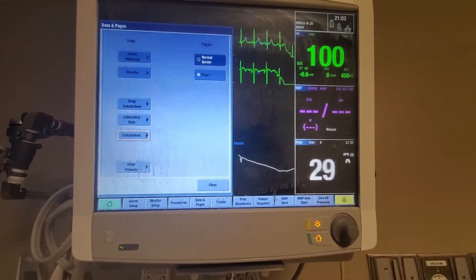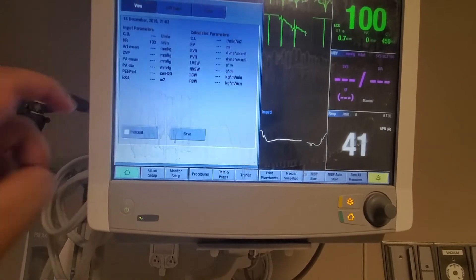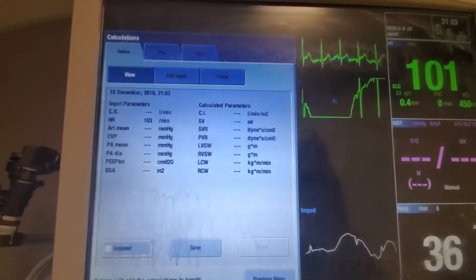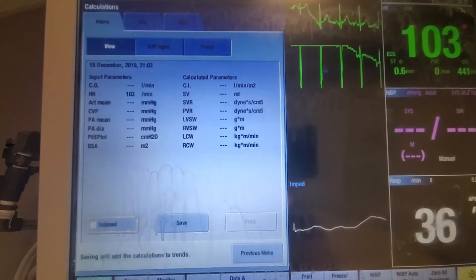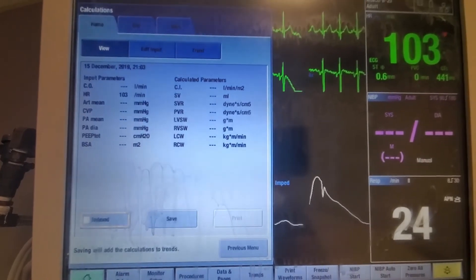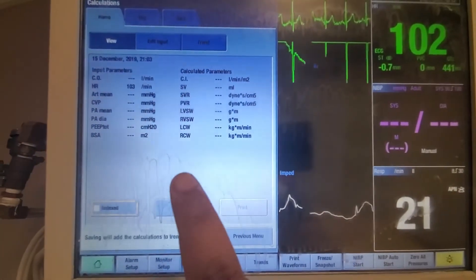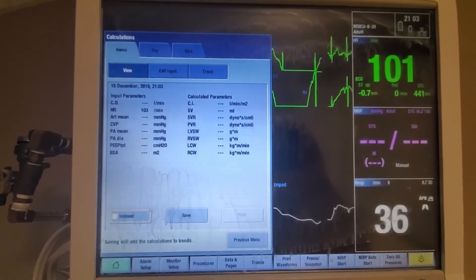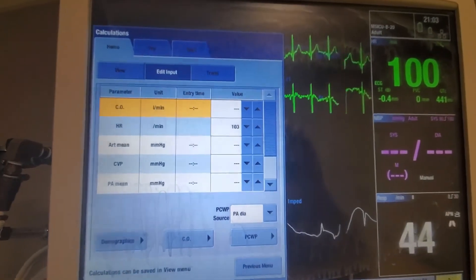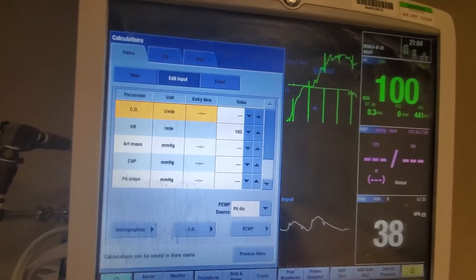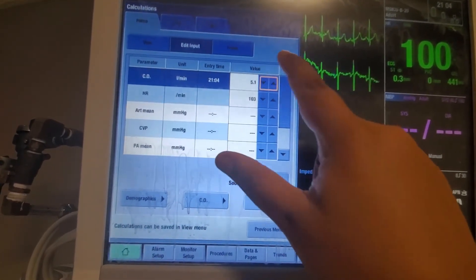The last thing I want to cover is the data and pages section. Click there and go to the calculation section, which is handy because it can calculate hemodynamic values for you. Some values will come directly from your monitor if you have a pulmonary artery catheter, arterial line, or CVP setup — it pulls that information automatically. You can always edit your input manually. I'll go ahead and edit since I don't have all that set up — cardiac output we get from the Hemisphere, so I'll enter that in.